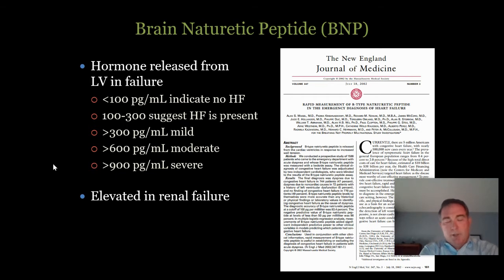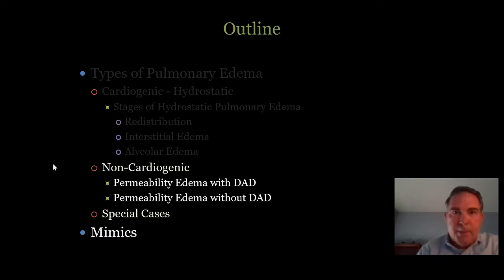Would be great if we could dive into the chart for every case. We can't, but certainly ones that strike you as something, looks like edema, but the heart's a normal size, or it's a young person. Certainly take the time then to investigate a little bit. Good, so that was just a quick run through of cardiogenic or hydrostatic edema. Hopefully that's pretty straightforward. We'll run through some non-cardiogenic edema and then show some cases.